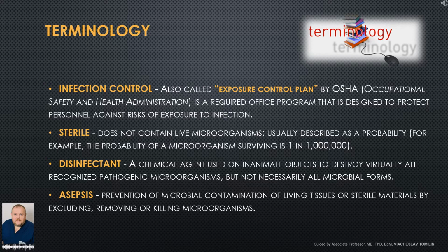Disinfectant: a chemical agent used on inanimate objects to destroy virtually all recognized pathogenic microorganisms, but not necessarily all microbial forms. Asepsis: prevention of microbial contamination of living tissues or sterile materials by excluding, removing or killing microorganisms.